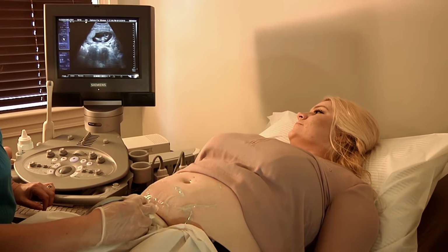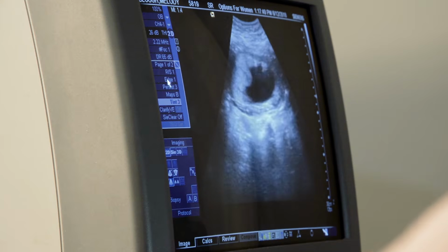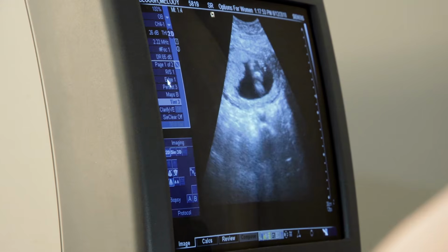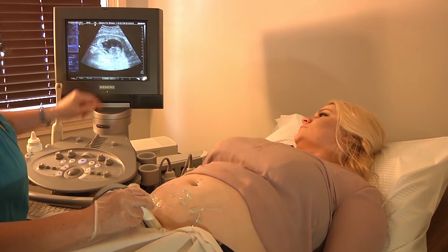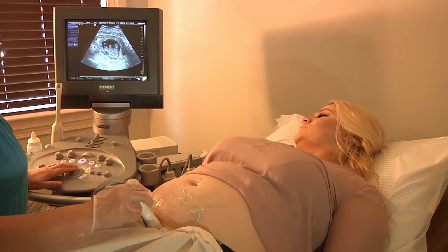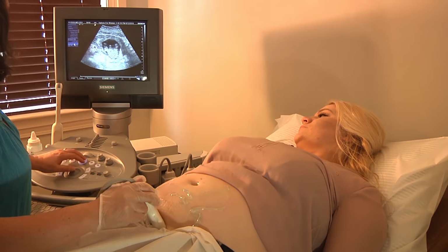Okay, now she went transverse, and she's going from inferior to superior. She just needs to bring her depth up to where it was before. Keep going until you get that right. Okay, that's an umbilical, so she'll take the transverse. Yeah, that would be our transverse midline.